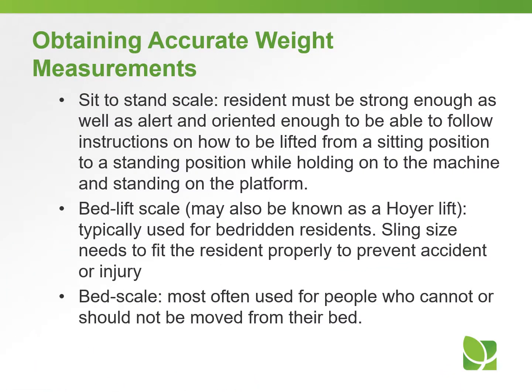Sit to stand scale: the resident must be strong enough as well as alert and oriented enough to be able to follow instructions on how to be lifted from a sitting position to a standing position while holding onto the machine and standing on the platform.